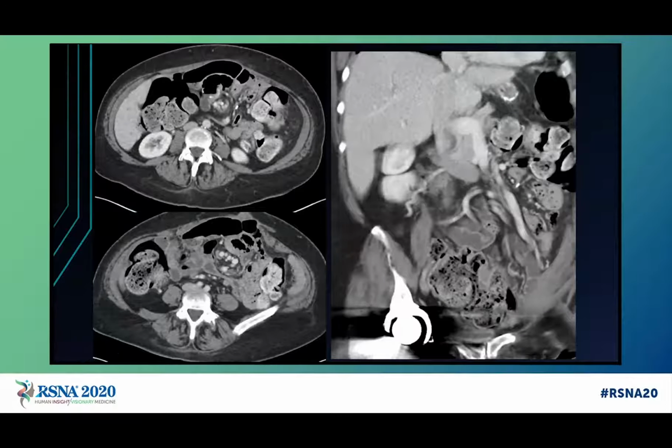Here is a patient, another gastric bypass patient, another patient with the jejunal anastomosis in the central abdomen, which is not typical. The mesentery appears swirled. There is bowel going behind the root of the mesentery here. And on this coronal MIP image, notice that the superior mesenteric vein is markedly narrowed at the site of this twisting. So all signs that you're dealing with an internal hernia, which was confirmed operatively in this case.